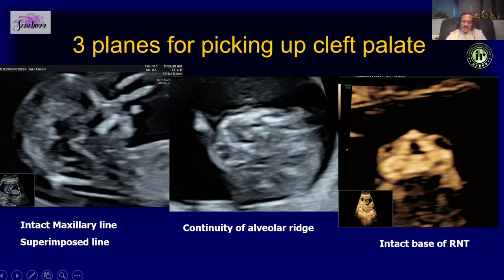The vomer is superimposed on the palate. So if there is a cleft in the palate, what you see is a single line — or absent superimposed line sign as she calls it — where basically only the vomer is visible.